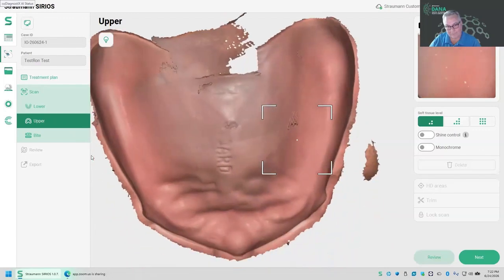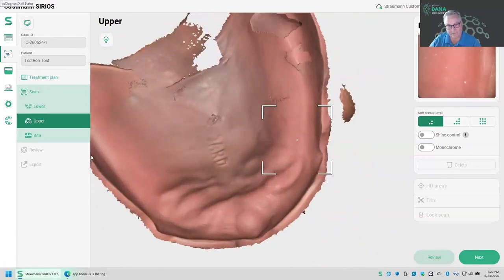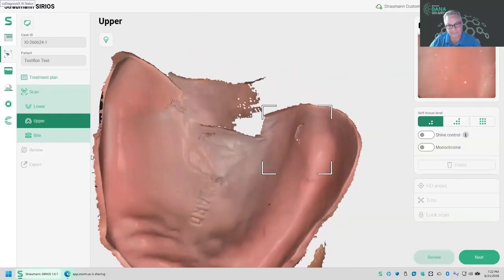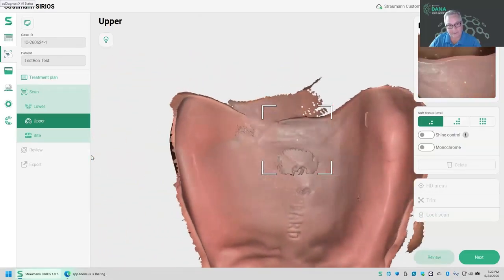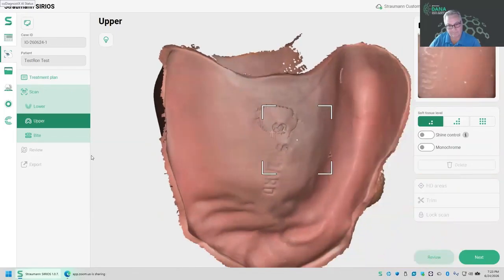Each time I notice a little bit of a dimensionally inaccurate surface there, you'll notice I go back to a known surface and just come back over to fix that little anomaly. Okay. And then we come back over this. And let's fix that as well.